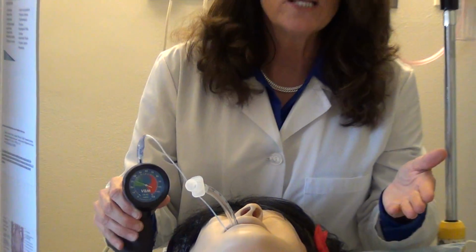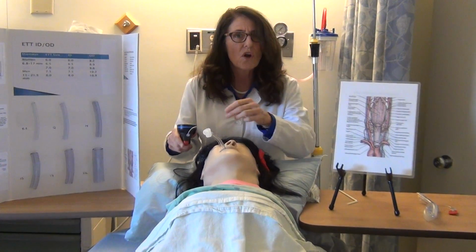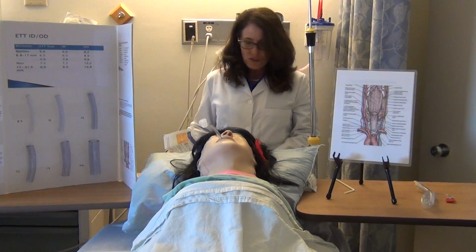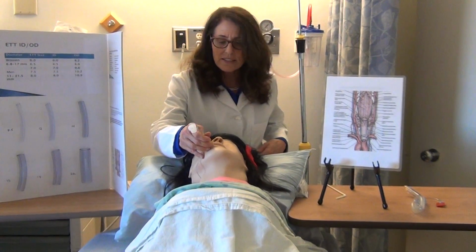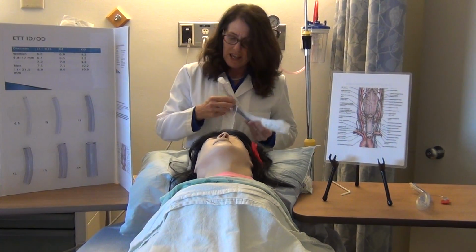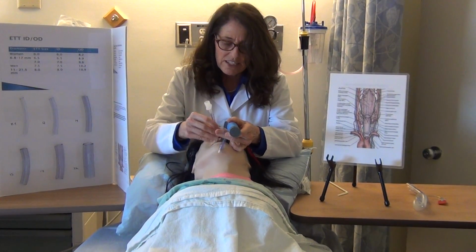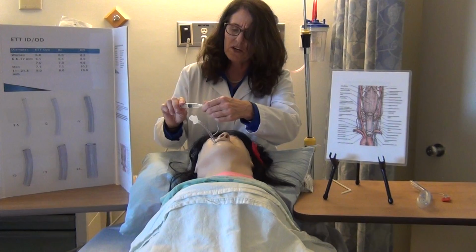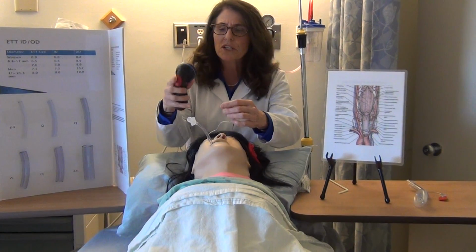Actually, let's go back to even the second standard that's needed, and that's I want to base my practice on research and evidence-based care. And what that says is a size 6 endotracheal tube has less complications than a size 7. So I'm going to take a size 7 out, and I'm going to use this size 6. And once again, I intubate Peggy Sue gently, insert the size 6 endotracheal tube, and let's say I'm going to put in maybe 4 cc's of air right now, 4 to 5, but what I'm going to do is immediately check with the cuff manometer.